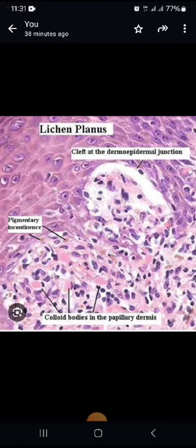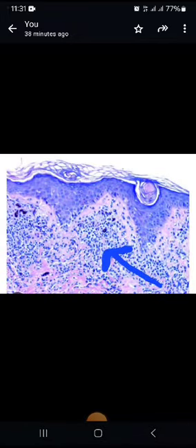Colloid bodies are also present. These are basically dead keratinocytes, represented by pinkish eosinophilic material.